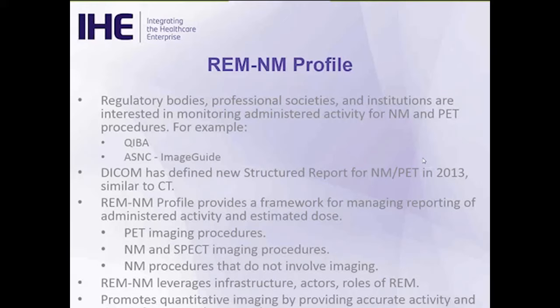So in 2013, DICOM added the structured report that is used in the REM-NM profile to support reporting this dose information. So REM-NM provides a framework for managing the reporting of this administered dose. It can be used for PET imaging procedures, general nuclear medicine, so often known as just NM or SPECT, and even procedures that don't actually involve an image at all can be supported in this profile. And as I said, the intent, and I think we succeeded, is that in this profile we tried to leverage as much of the infrastructure, the actors, and the roles as already existed in the REM profile. And as I mentioned, one of the other benefits is it's going to help us promote quantitative imaging, because we can provide very accurate activity and time information into the imaging chain in the scanners.